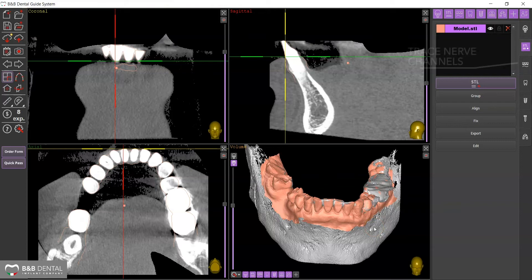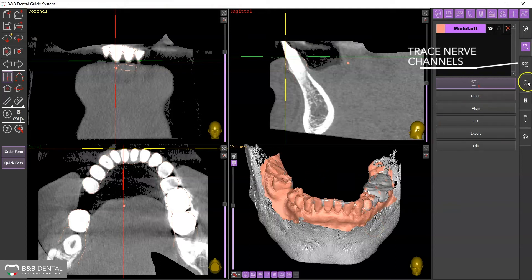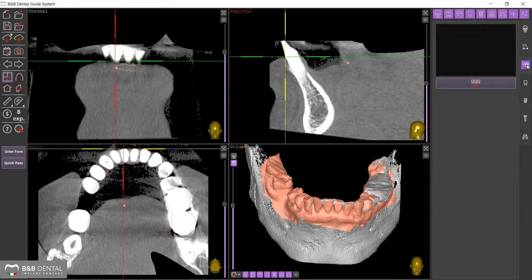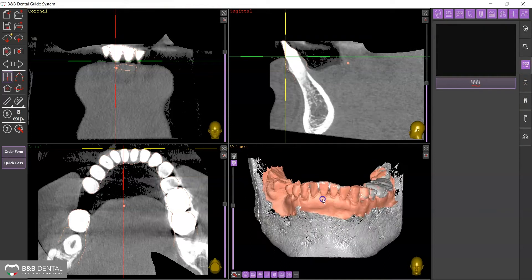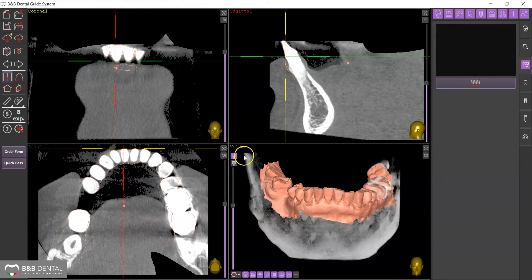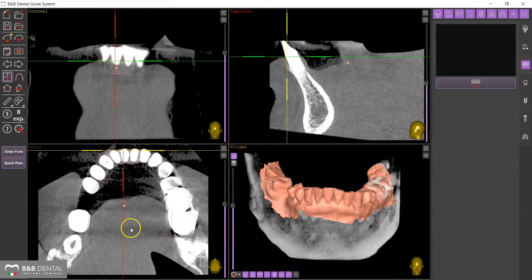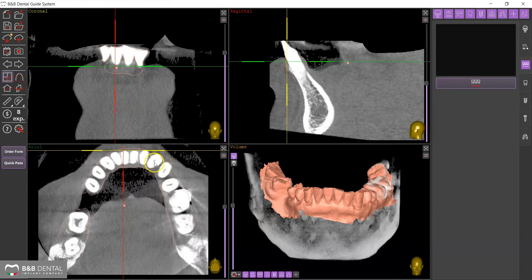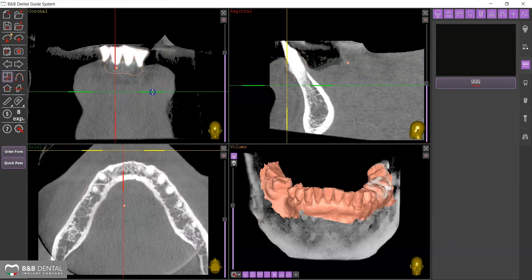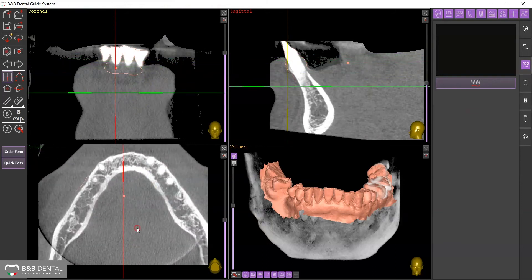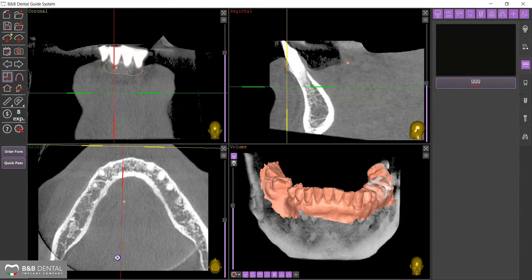Determining the position of the nerve is essential for avoiding any implant positioning problems and for generating an automatic warning in case of planning errors. For the insertion of the mandibular canal, select by clicking on the corresponding tab from the right side panel.